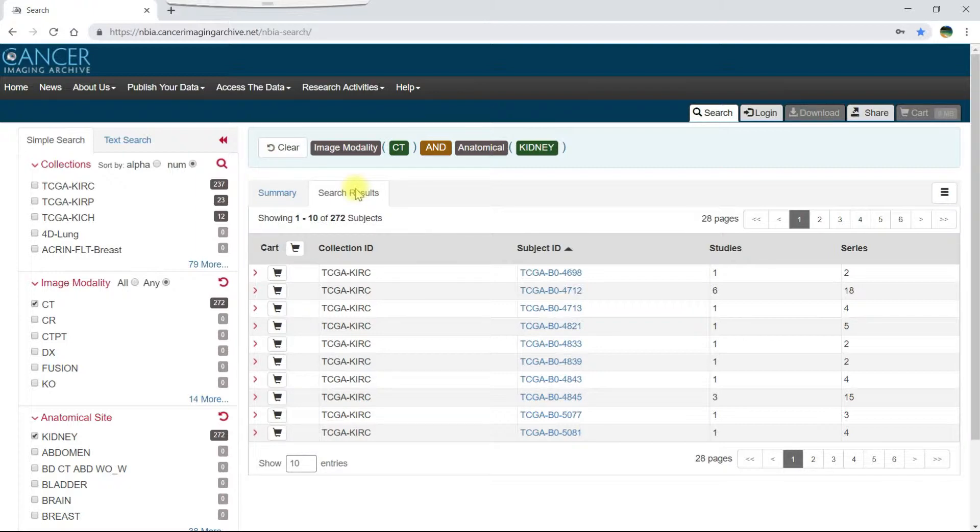When the search results first appear, each row represents one subject. The subjects are organized alphabetically by subject ID.